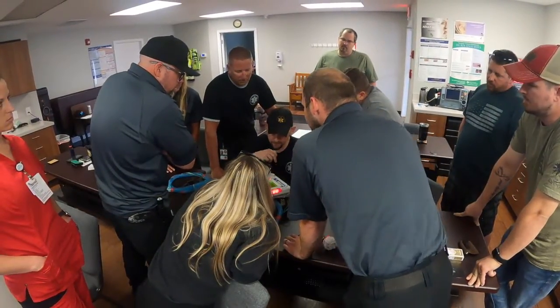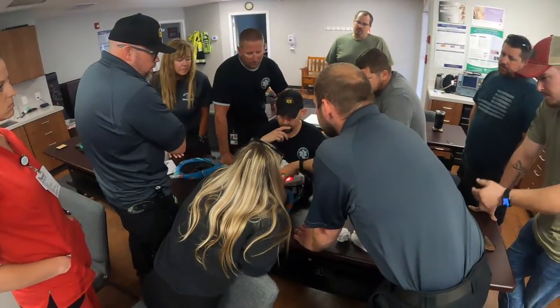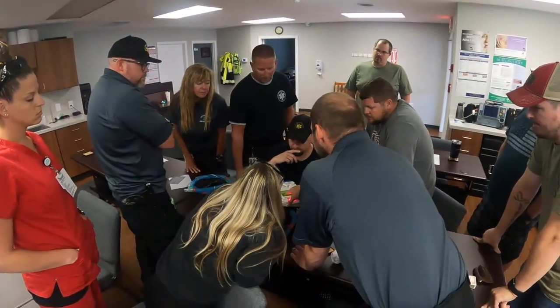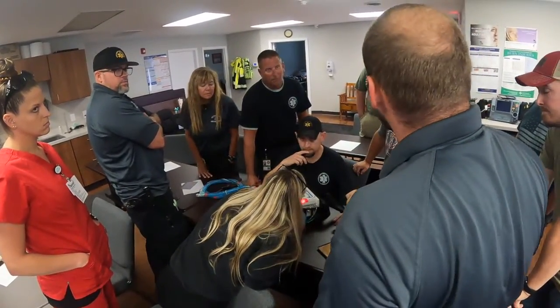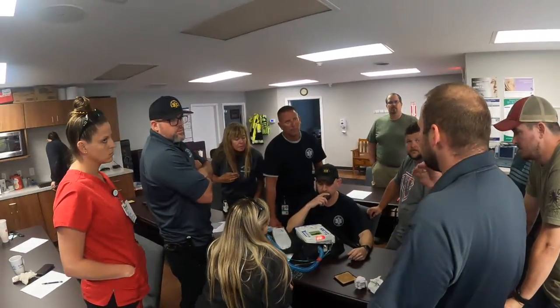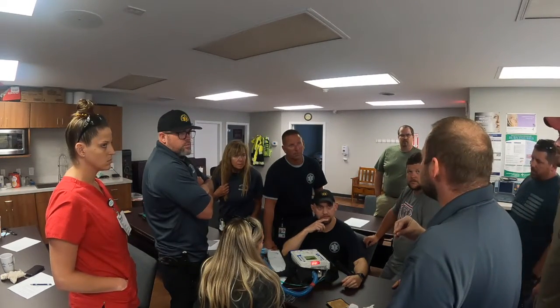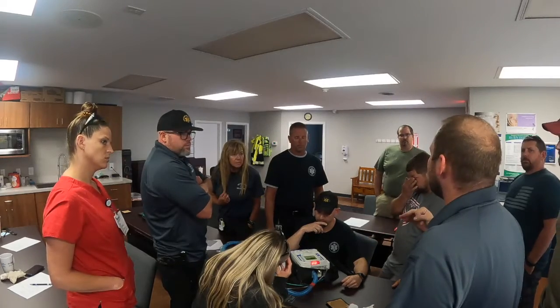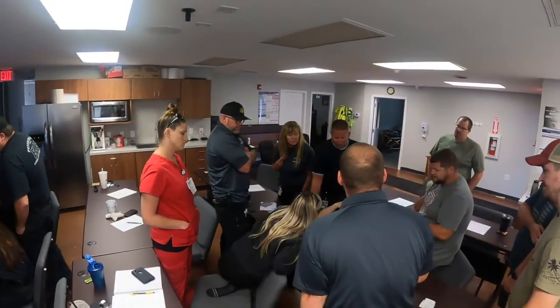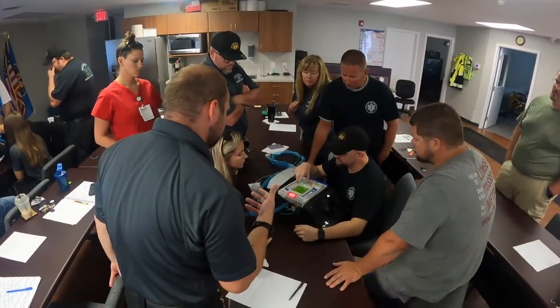So we are actually doing high pressure alarms. Your alarms are set here off on the side. You can control this by pressing your menu button and highlighting it. My suggestion is when you set your high alarms for your pressures, set it 5 above your target, and about 5 below the lowest one you want it to be. Most of the time, 10 or 15 is good for that, and a PIP of 30 is okay as an initial alarm. So go ahead and change it to 30.